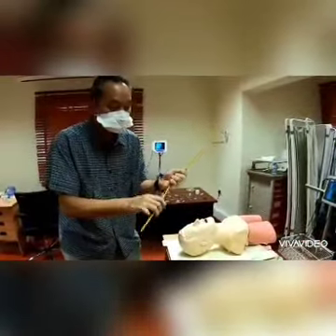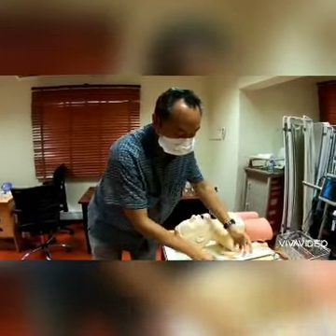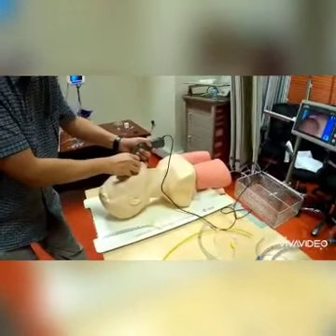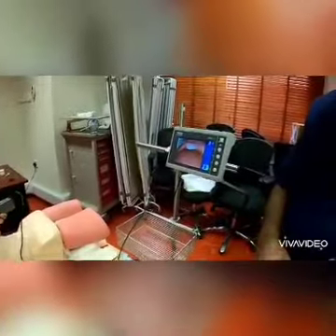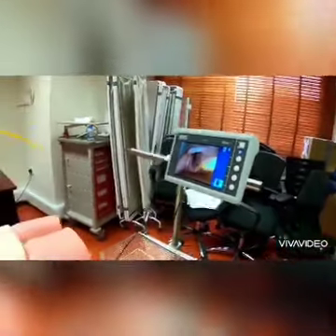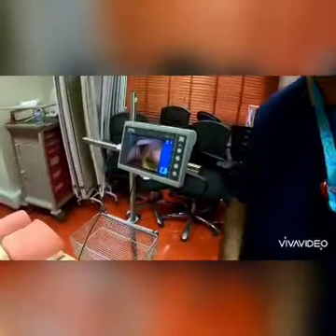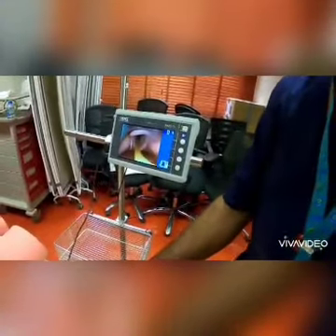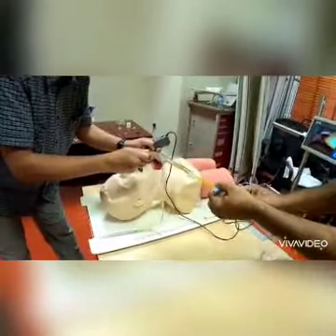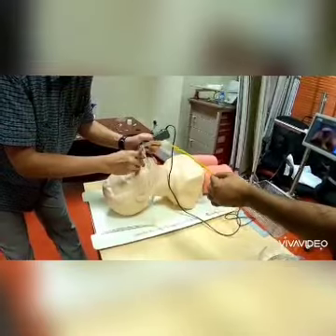So when you get this bougie, you mold it and it develops some sort of curve, and you do the same technique. You slowly insert your laryngoscope blade, a two-handed technique. Once you're inside the vallecula, you very gently insert your bougie using the curve through the vocal cord. Once you're inside the vocal cord, you get your assistant to help you put the ET tube. Again, the same way, you need to be careful not to injure the ET tube cuff on the teeth. Once you're in, you advance your ET tube.